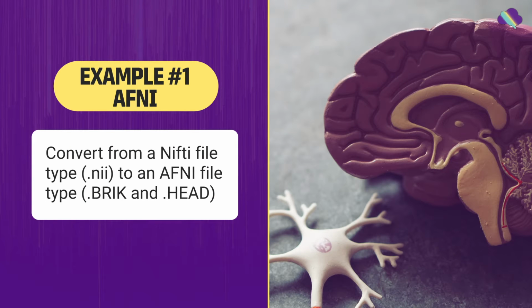Let's run a simple job through NeuroStack to see how it works. We're going to convert an MRI file from one file type to another. We're going to use an AFNI program to convert from a NIfTI file type to an AFNI file type. The job should only take a few minutes to run so you can see the process from beginning to end.